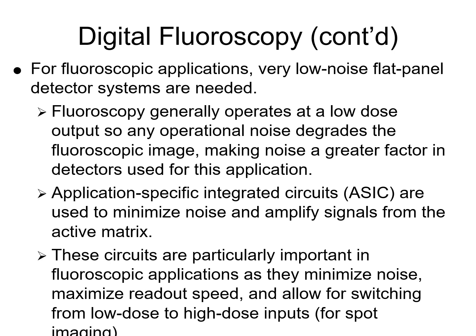Okay? So when the electrical engineers build these things, when image receptors are designed, it is an integrated circuit device. It's got electrical components in it, and those have electrical noise, or random motions of electrons. Well, if we don't engineer correctly and put in circuit controls to keep electronic noise at a minimum, then we'll get very noisy images. So what you're figuring out here, and what you're going to be quizzed on again in digital imaging, is that there's more than one source of noise once we turn this into a digital image.